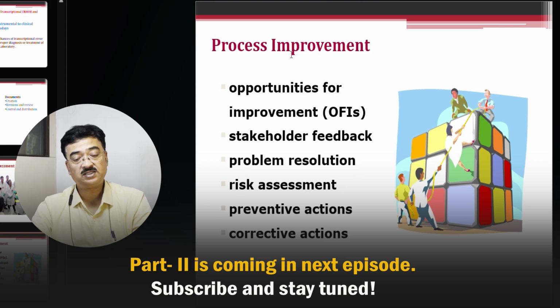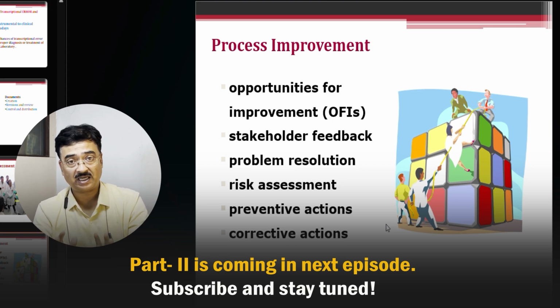So once you have done all these things, you have found your faults. Now take corrective action, then take preventive action. Again, I am describing: corrective action means solve the problem. Preventive action means to ensure that this should not be repeated again, and if repeated, the action is taken care of.